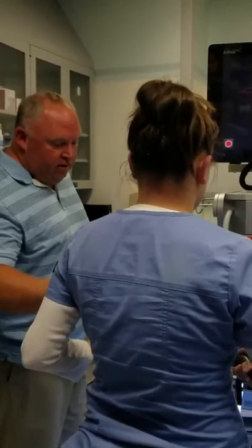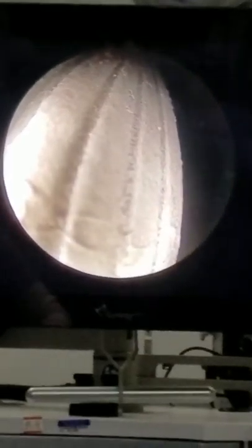Alright. Find the red dice. You just want to put this in this hand, you're going to put this in this porthole, and you're going to touch the two together. Okay? That's right, we're in it. It's a little brain trickery. Down is up, down is up, up is down, left is right, right is left. Is that it? I guess it's right for part two, the only thing. Close, we're driving in.